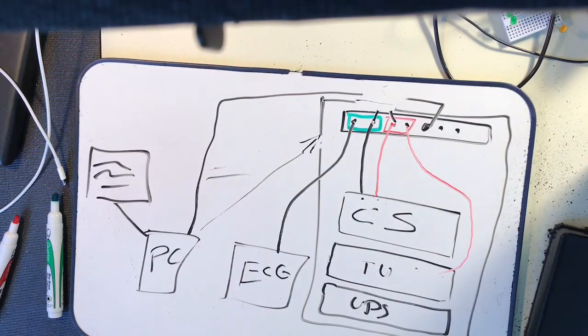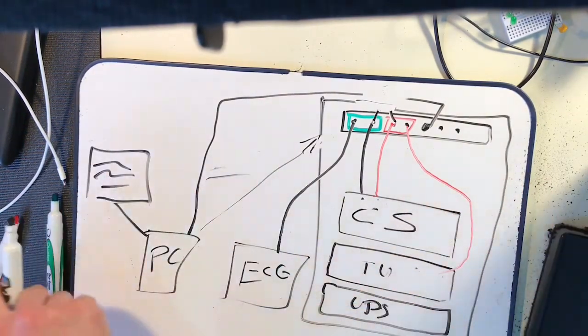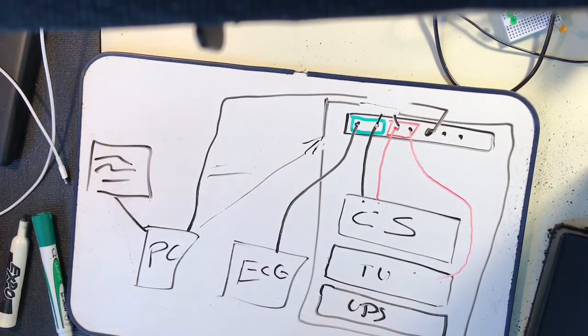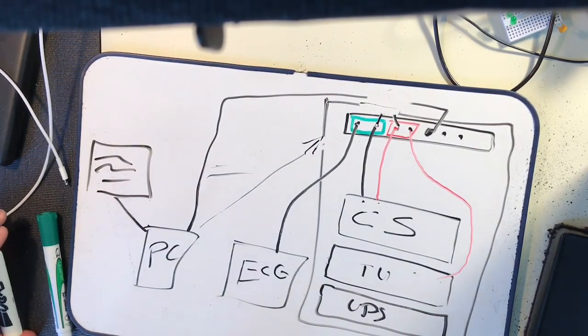But I'll probably do another video on how to set up the switch in particular, but hopefully that gives a better example of what these are used for. If you don't 100% get it, don't worry about it. It's rather advanced networking stuff. But in order to set these machines up, you need to use VLANs, and this will show you at least what VLANs are.